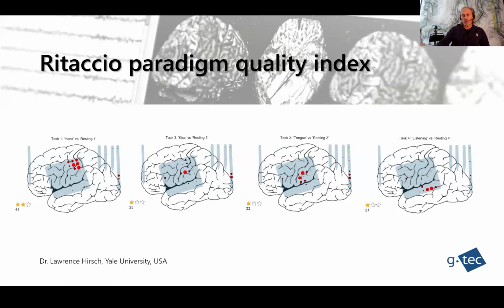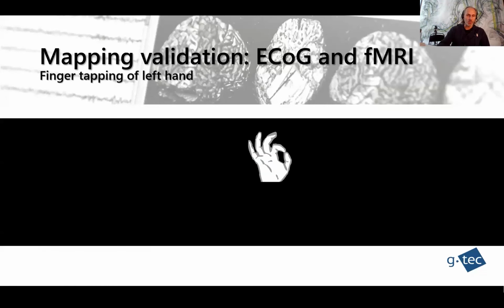And this is the information actually that comes out of cortiQ, and this is handed over to the surgery team. And then they know they should not remove this region here because the patient couldn't kiss anymore. This would be, of course, a nightmare.